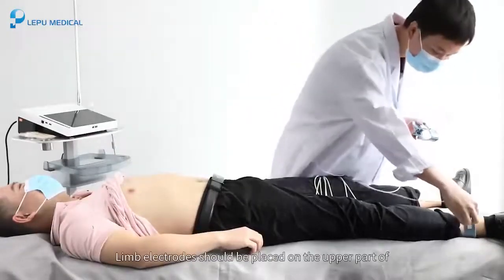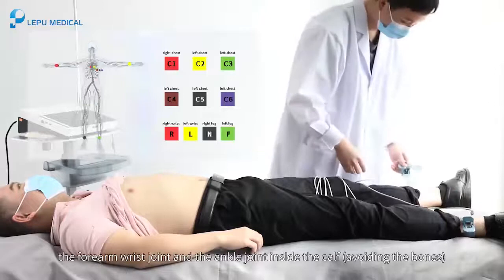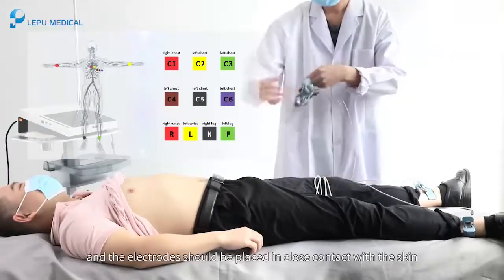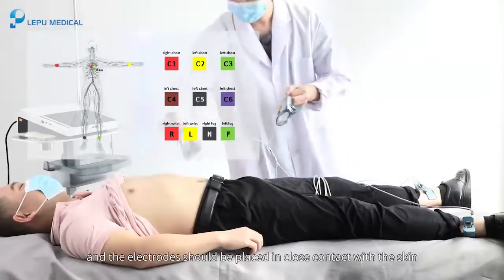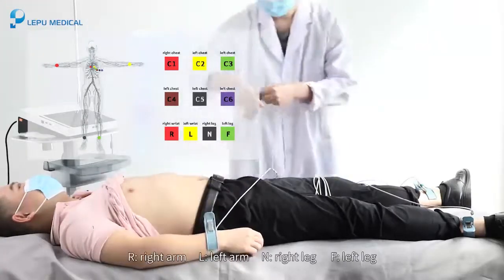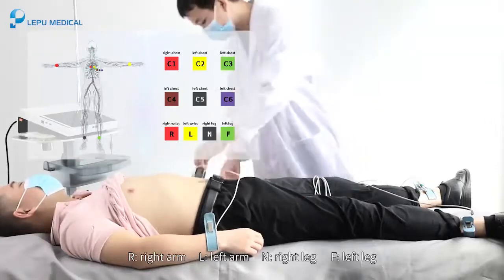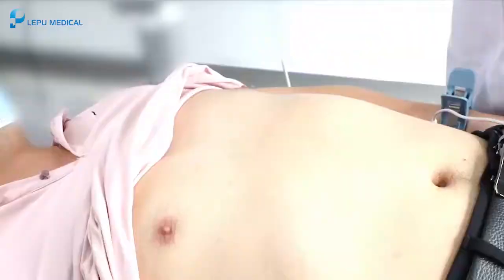Limb electrodes should be placed on the upper part of the forearm wrist joint and the ankle joint inside the calf, avoiding the bones, and the electrode should be placed in close contact with the skin. R, right arm. L, left arm. N, right leg. F, left leg.